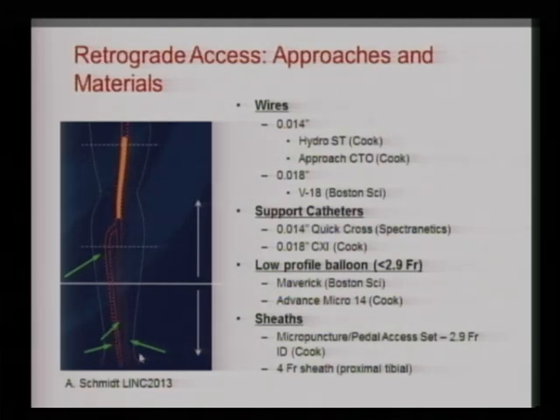It's very easy to access the dorsalis pedis or distal anterior tibial artery and the posterior tibial artery at the ankle level. Also in the lower leg, you can directly access the peroneal artery through the interosseous membrane using an approach from the anterior side. In the proximal leg, if you're trying to deal with a popliteal artery occlusion, actually the proximal anterior tibial artery turns out to be a very good target and probably is the most useful target in the upper leg.